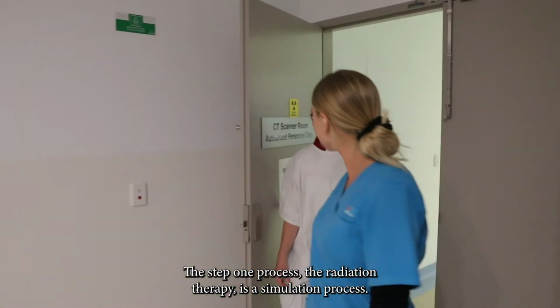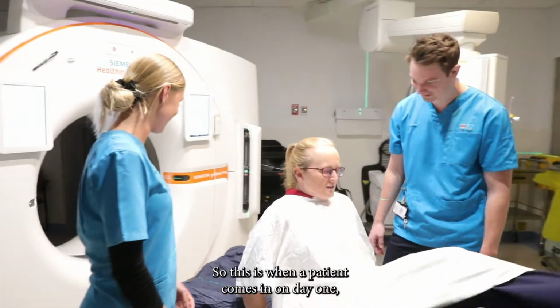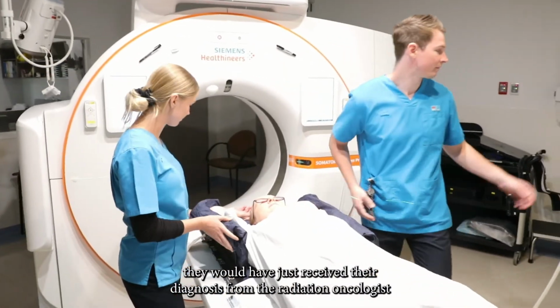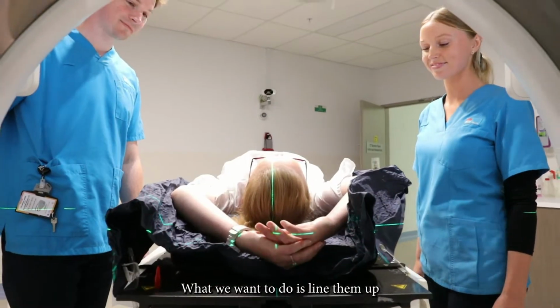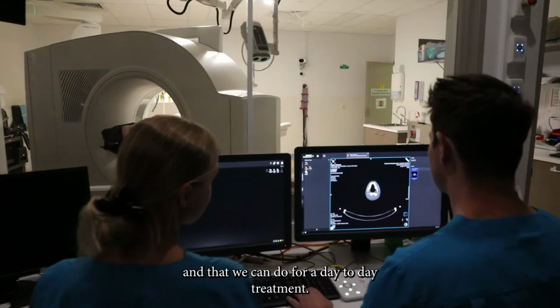The step one process of radiation therapy is the simulation process. So this is when a patient comes in on day one. They would have just received their diagnosis from the radiation oncologist and they've come in for their first CT. What we want to do is line them up and put them in a position that is reproducible and that we can do for day-to-day treatment.